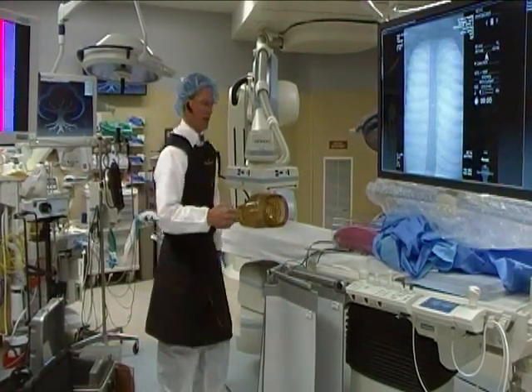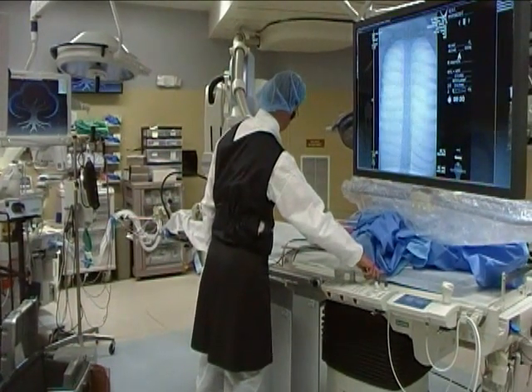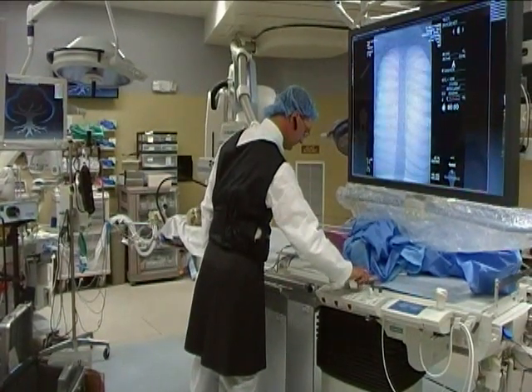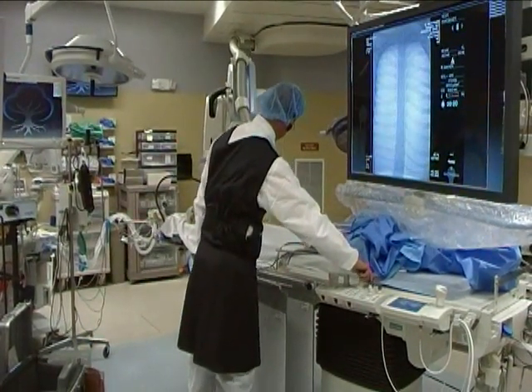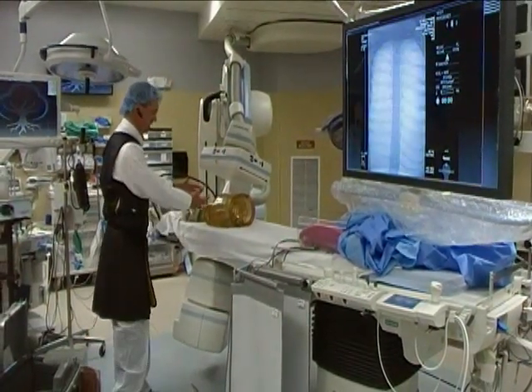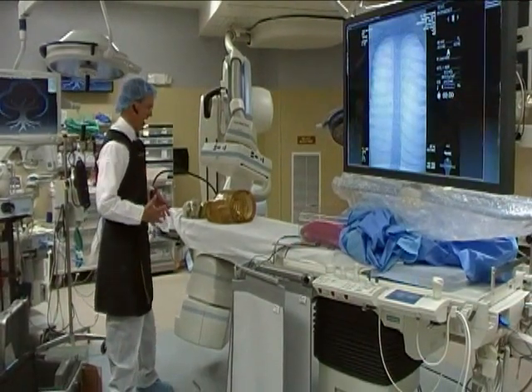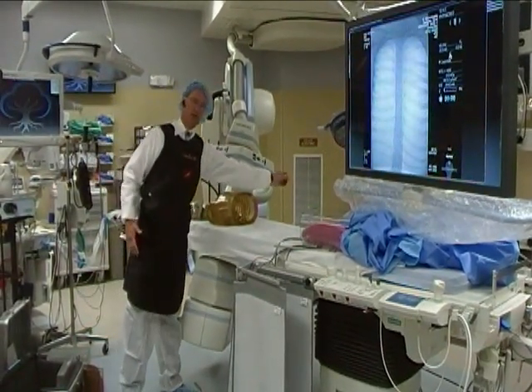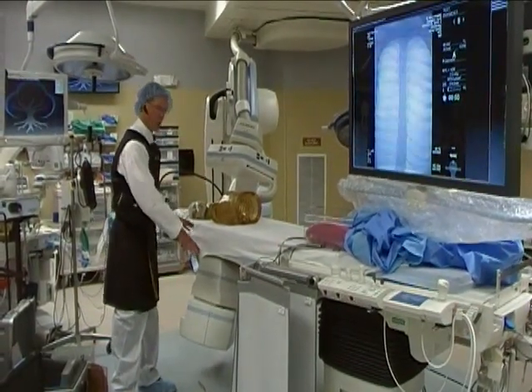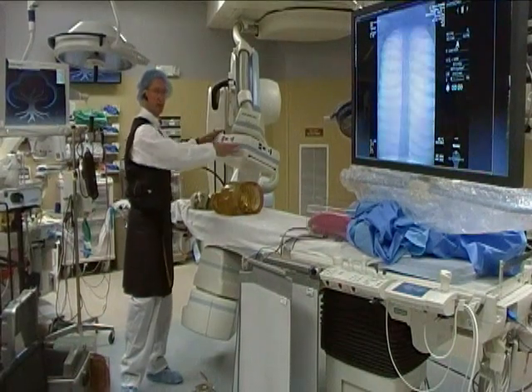As we move to different angulations, such as this, now the scatter is more likely to come out toward the operator here, and there will be less on that side. So there will be more radiation coming back toward the tube at all times compared to what's coming out this end.